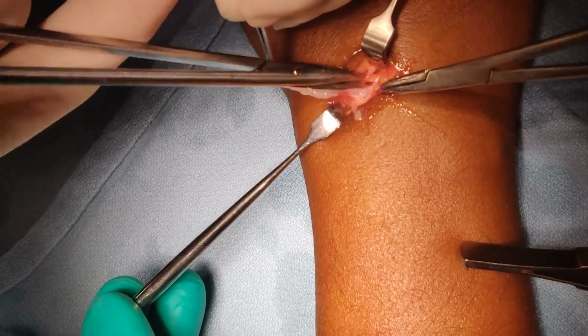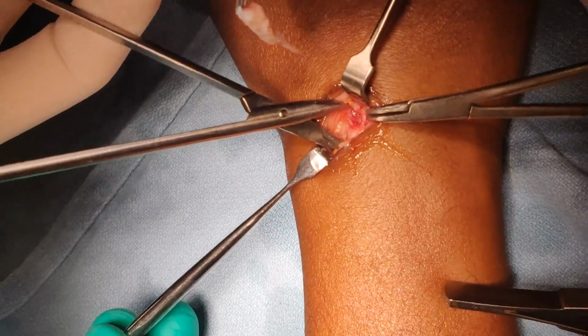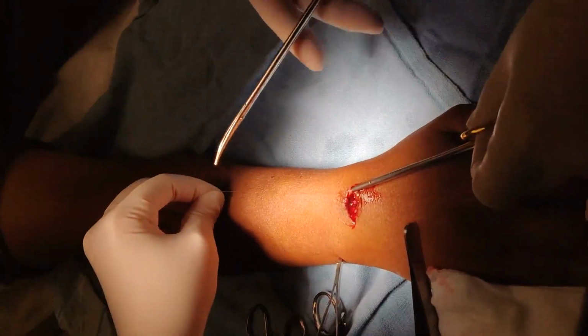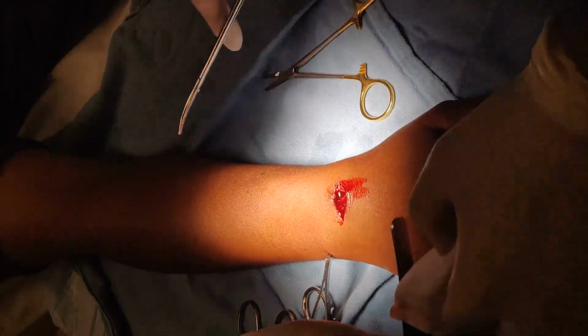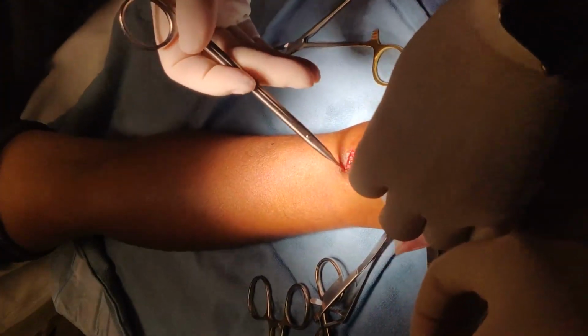In these cases, your doctor may refer you to a hand surgeon for surgical removal or aspiration of the cyst. Aspiration would entail drawing the liquid material out of the cyst using a needle, followed by the injection of corticosteroids as anti-inflammatory compound. Firstly, local anesthetics are injected to induce insensitivity in the area before operation.